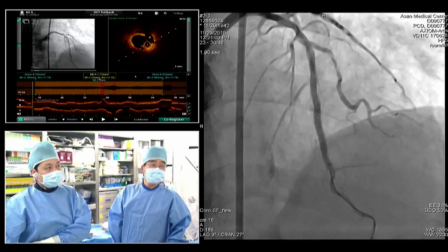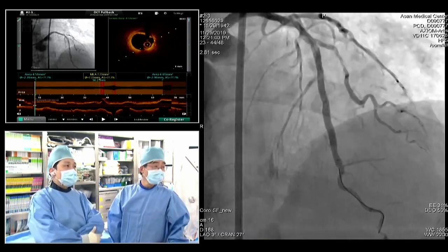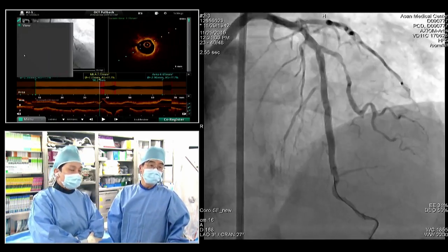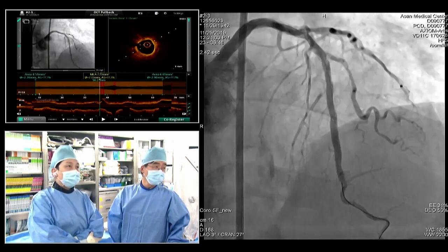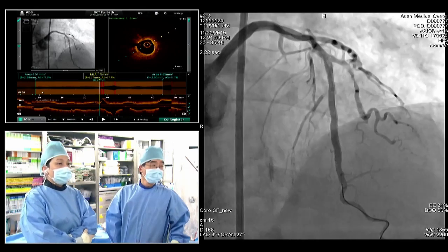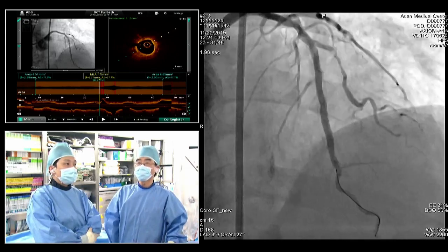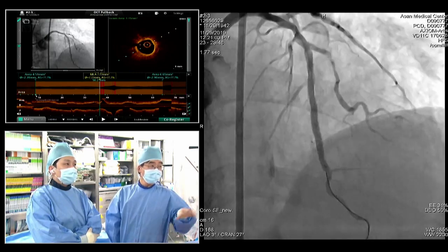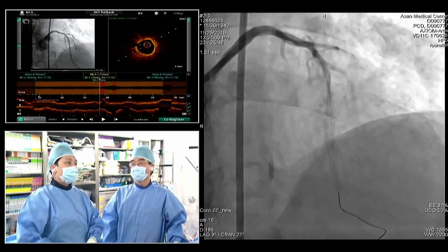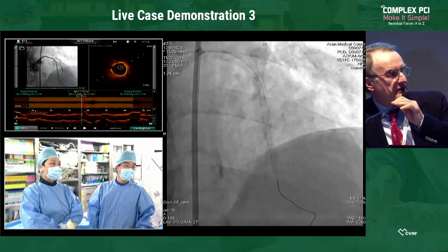And now the next step is how do you fix the proximal part? Did the ST elevation resolve after you placed the stent? Yes. We are waiting for a more comfortable and safe situation. So we fixed the distal part, and we are waiting to decide what kind of treatment is better for the proximal margin of the stent. So do you just think DB? Do you think that the ST elevation was maybe also caused by some embolization?